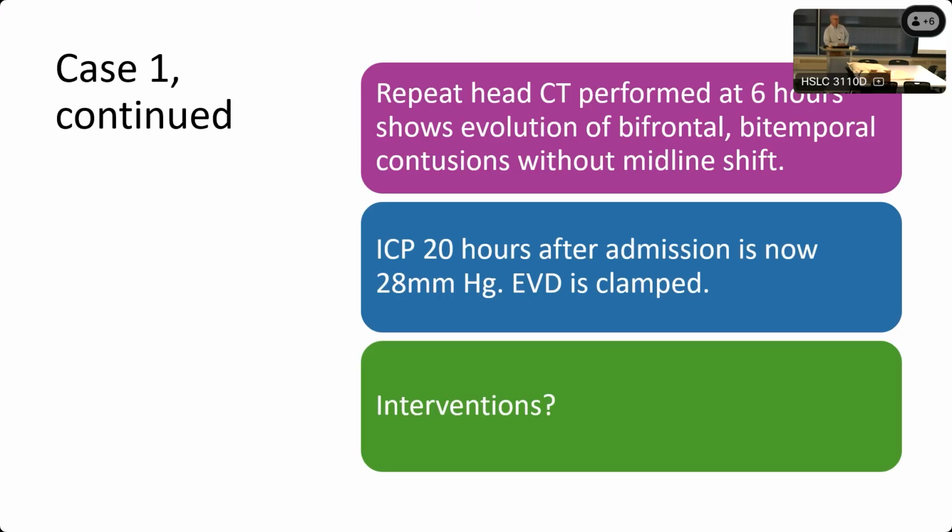Now, if you want to measure pressure without a transducer, again, we talked about it earlier, you can just measure the height of the fluid. When it actually leaks over the edge, that's the pressure on the inside. Now, you can't get a waveform very effectively. That's why we have transducers, the transducers being the waveform.